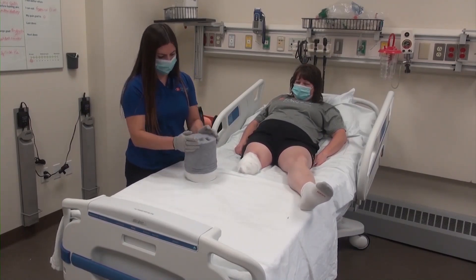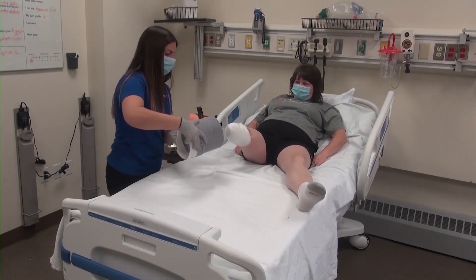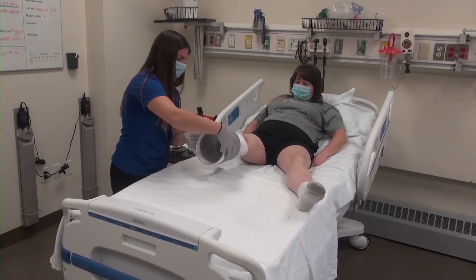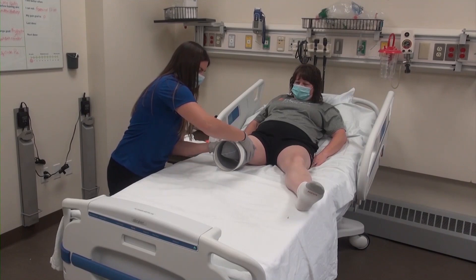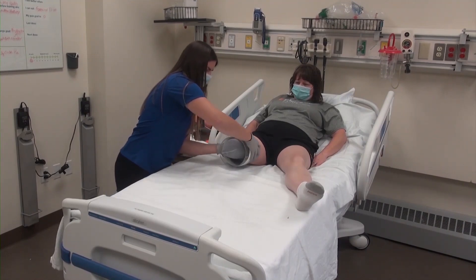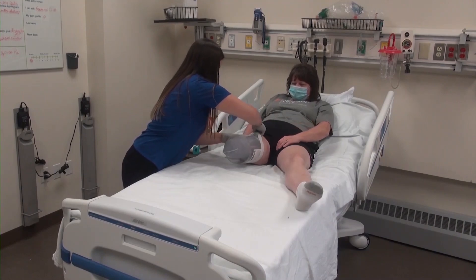From there, position the top of the flat shrinker at the distal part of the patient's leg and gently roll it on until the silicone beads make contact with the patient's upper limb. Ensure that there are no wrinkles or folds in the shrinker, as well as ensuring the bottom of the shrinker is snug to the patient's distal residual limb.